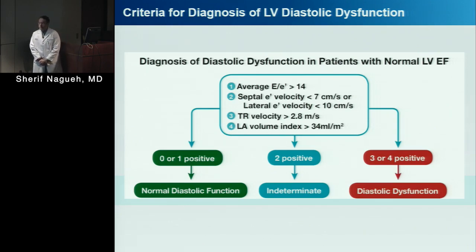And if indeed the heart size is bigger because the body size is big, really everything should get big. Meaning the right ventricle, the left ventricle, the left atrium, the right atrium, all of them should be big. So one index for our eye is to say, well, the left atrium is much bigger than the others, and therefore there's some conceivable pathology.